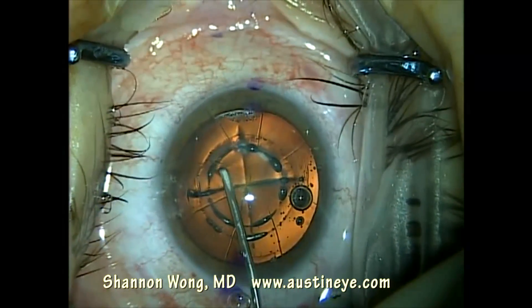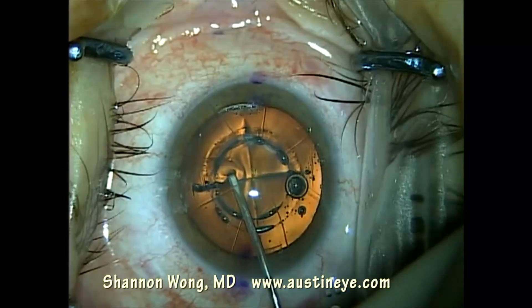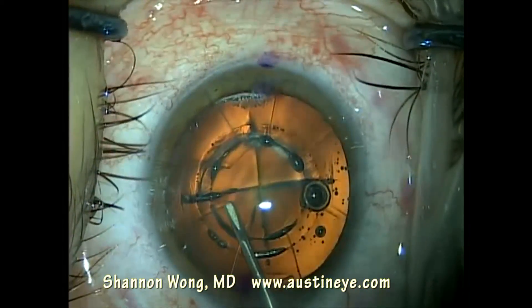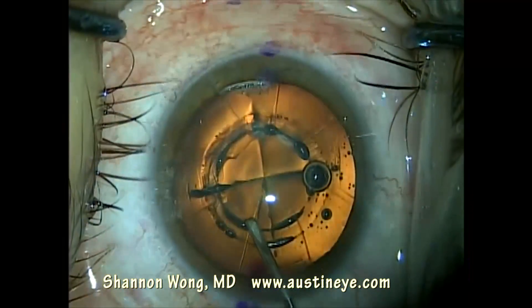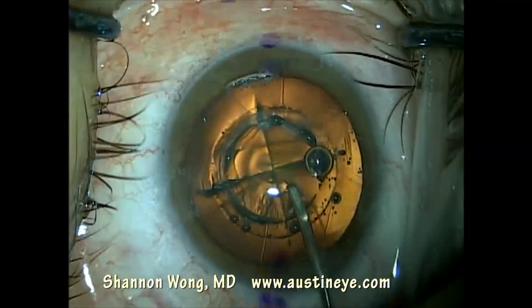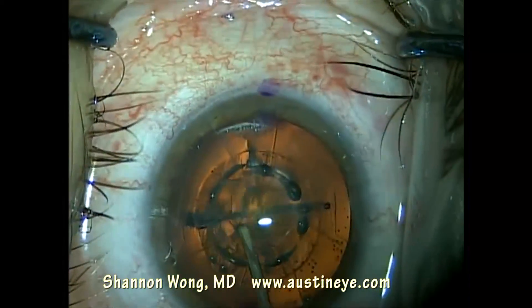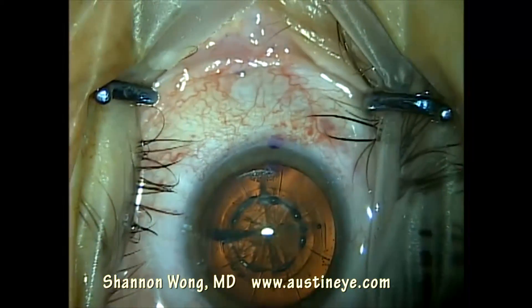I use a cystatome connected to the viscoelastic to just separate the pre-lasered capsulotomy. It frees up nicely, but we're being careful to make sure the capsulotomy has no focal adhesions. We work our way around, and at this point everything looks good — we're free and clear.